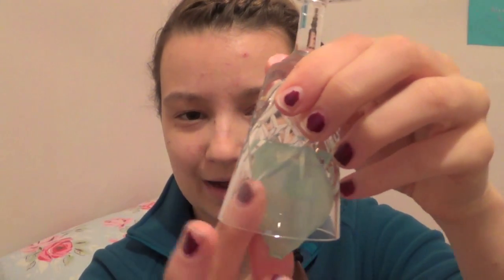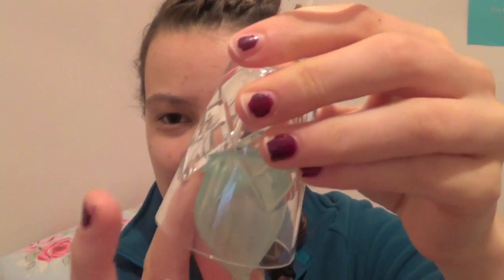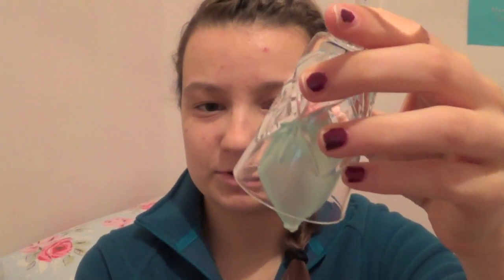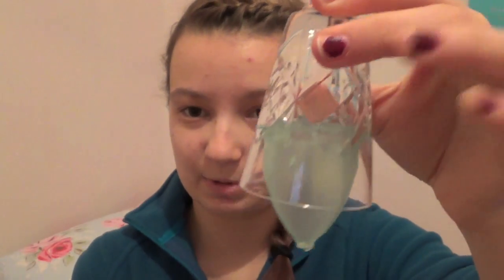Now you can see if you don't go all the way around, over here it still feels solid and open, but once you get past this bit you can feel, okay, there's a dip here. One of the tricks you can do is just to pull this down a little bit, and it should pop open.